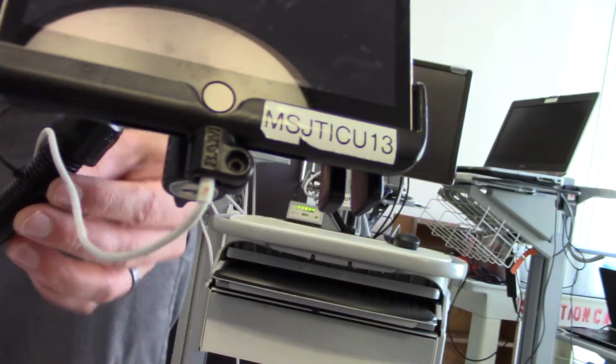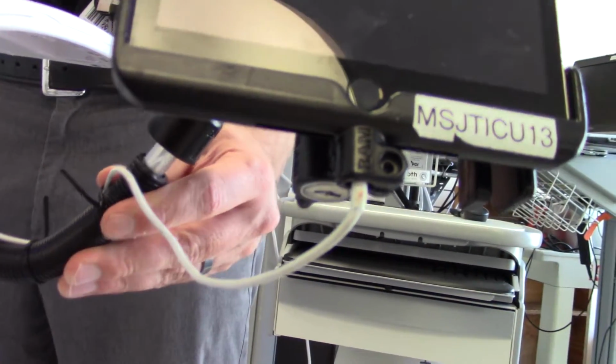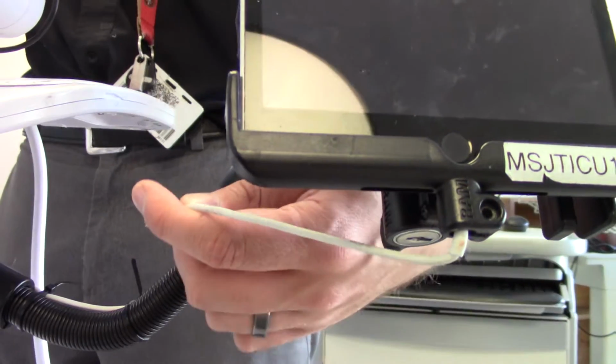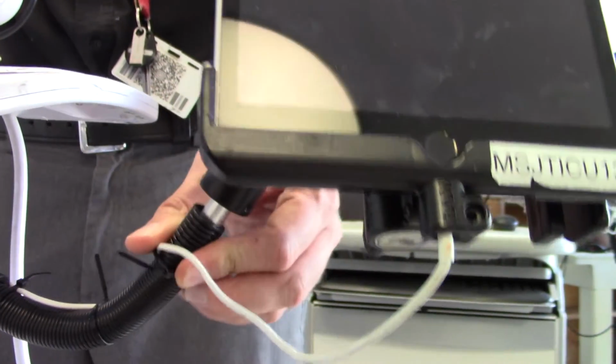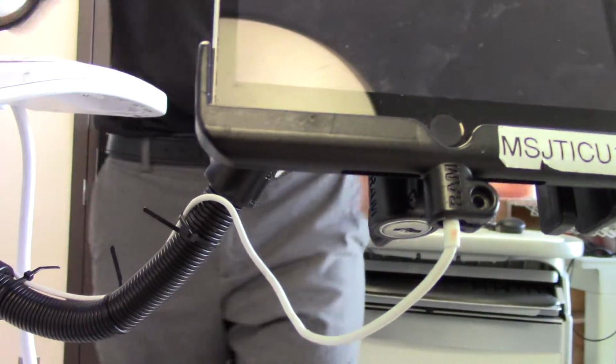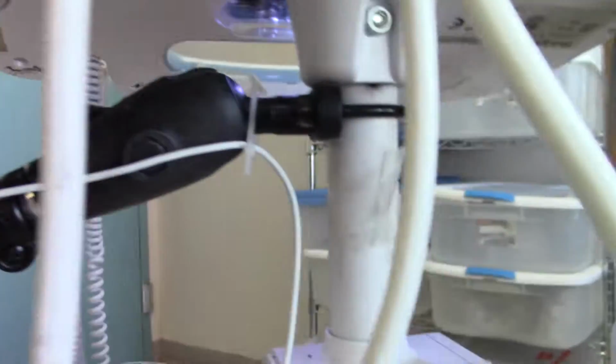Also, it's exposed. Some of them I've routed the cable inside this plastic jacket. But then it tightens it up more, and then you get wear and tear at the exit node from where it slides out of this plastic jacket. So usually they're just zip tied in, and then it runs down along the frame here, which you can see on the back, and then of course this takes us down to the little power harness.